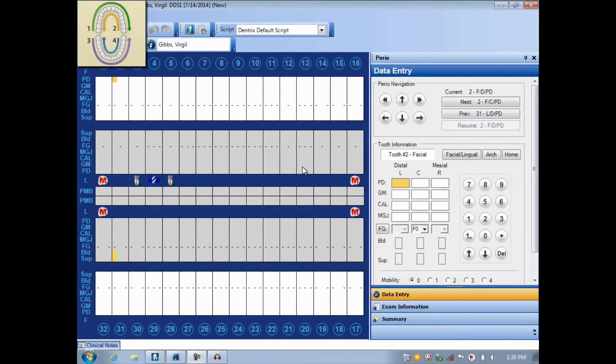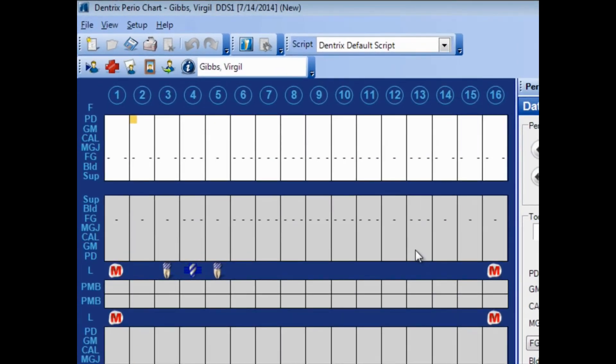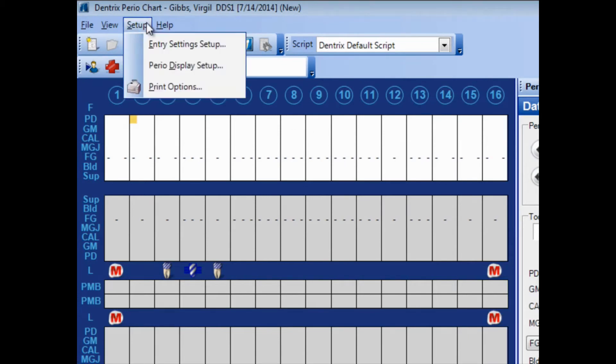Having a plan as we go into the setup window is very important. And you'll see how this makes it so much simpler as we go right now into the setup window. So here in the Perio chart, click Setup, Entry, Settings, Setup.